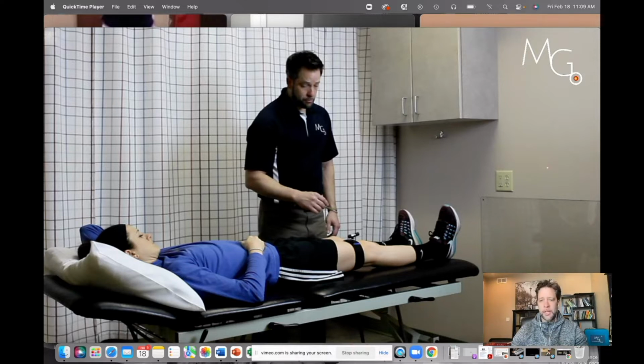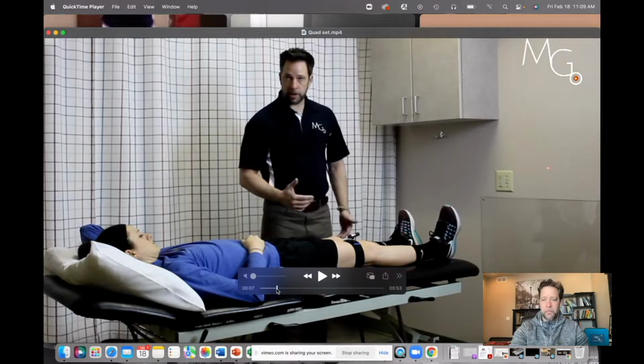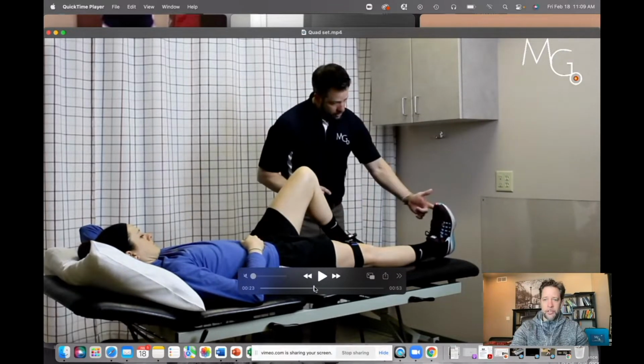If you have the clinician kit, you'll have a green rechargeable laser, or you chose the 2 options for battery-powered lasers. Once we turn that on, I want to project the laser onto the wall, as you can see in this video, or out in front of the patient. They don't even have to be close to a wall. You just want it over the top of the toe.